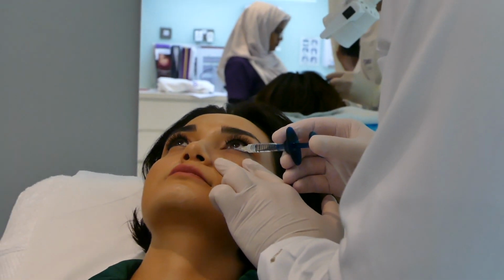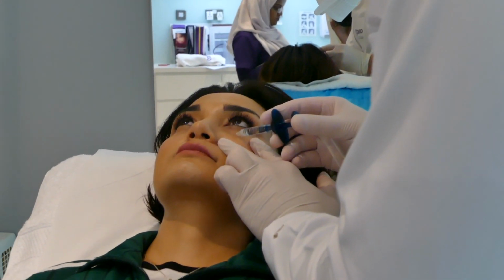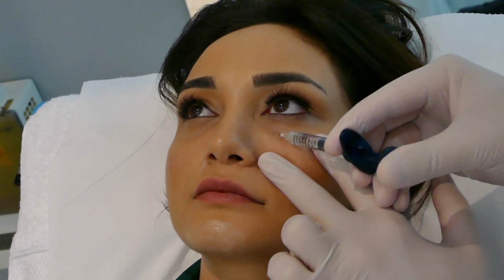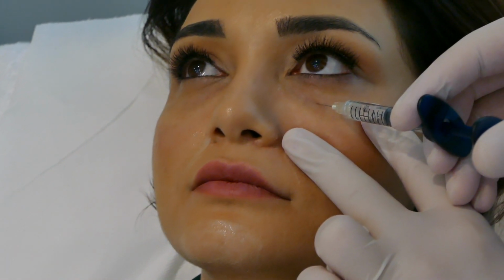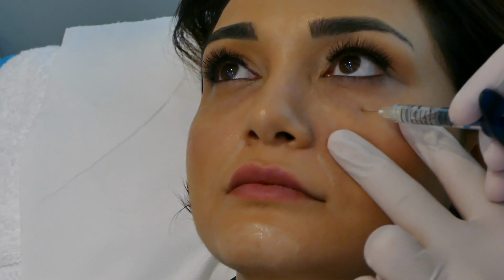Do you need to withdraw the plunger to see if there is intravascular penetration? In my opinion, when you withdraw, it's a two-hand movement, and often you don't get blood even if you are intravascular, because it collapses the vein when you create a negative pressure, and secondly, it breaks the filler gel in the syringe, and then you have air bubbles in that and it becomes difficult to inject.